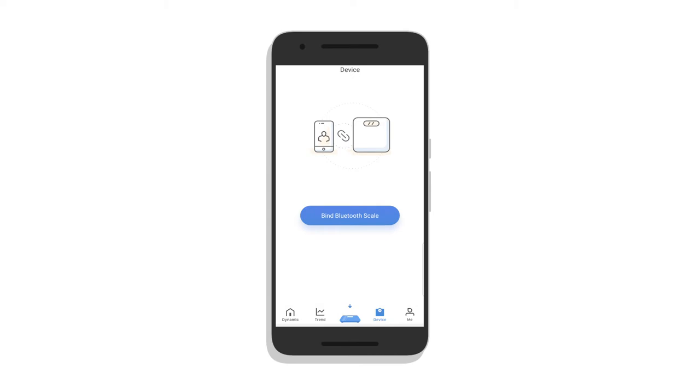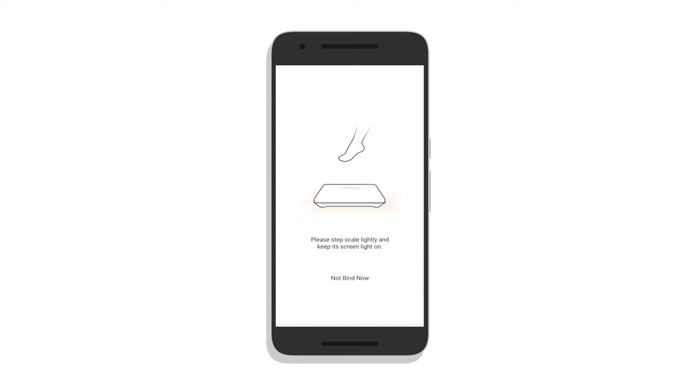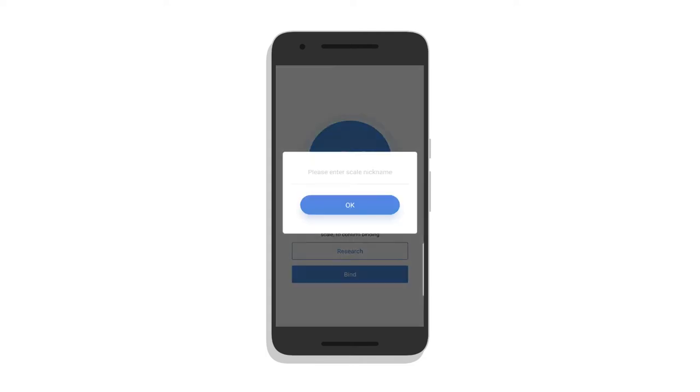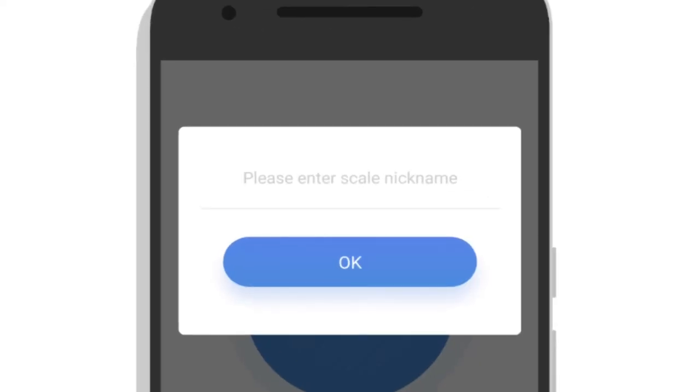When I open it, it prompts me first to create a profile. I go to Device in the lower part of the screen, click on Bind or Connect Bluetooth Scale, and step on the scale as it tells me to do, then click again on Bind or Connect. It wants me to enter a scale nickname because I can use more than one scale in a household.